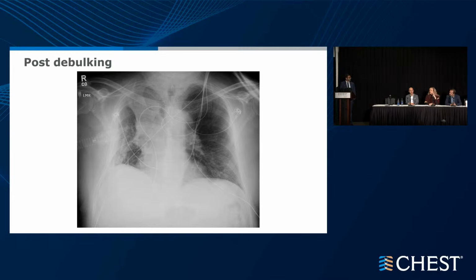And it's important for folks to always make sure when you're working in that space, I like that you highlighted that you were recognizing the normal boundaries of the anatomy as you were doing your debulking before you advance forward, because you can lose sight of the airway walls, and because the integrity is already breached, you could get yourself into the mediastinum very easily if you're not cautious. The same thing holds true with intervening with the thermal therapy. You want to be parallel to the natural airway anatomy so that you don't run the risk of perforation beyond what the patient already has.